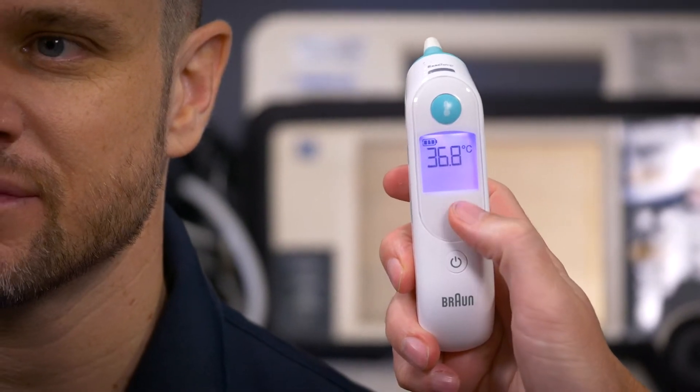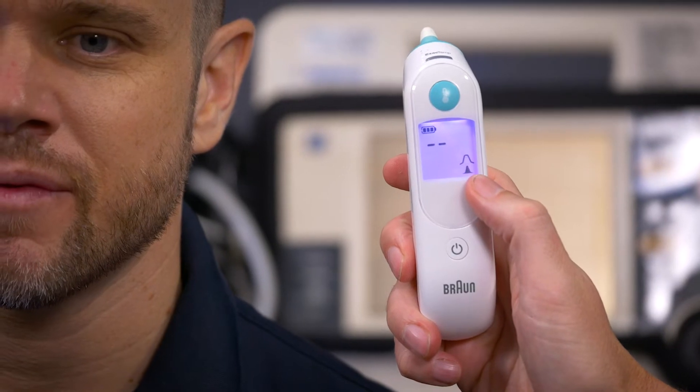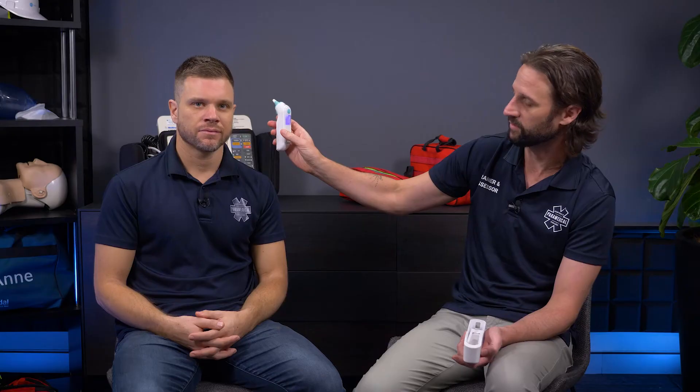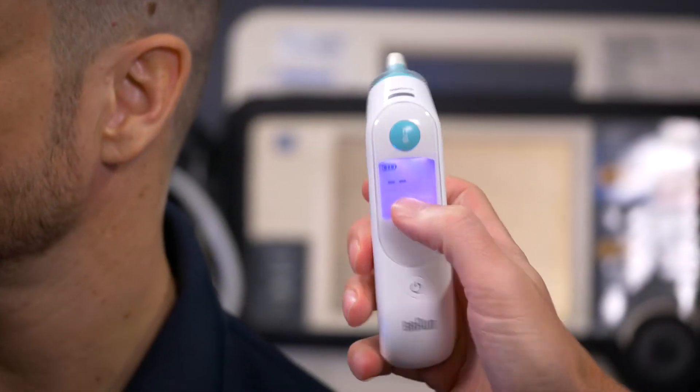That's the last temperature it recorded, but if we wait a moment for it to calibrate, you can see it's telling us to put the probe cover on. If I spin it around you'll see a little red dot there — that needs to be depressed by the probe cover, otherwise it won't work. The covers are up in here. Probe cover on, and now you can see it's ready to go.